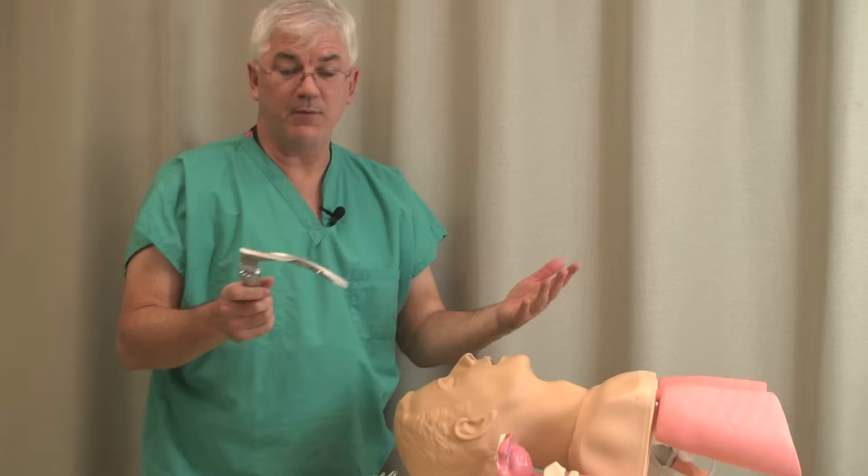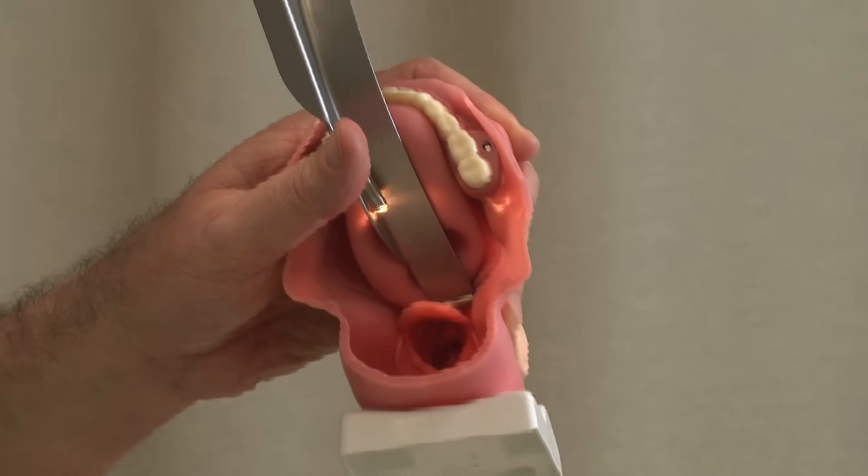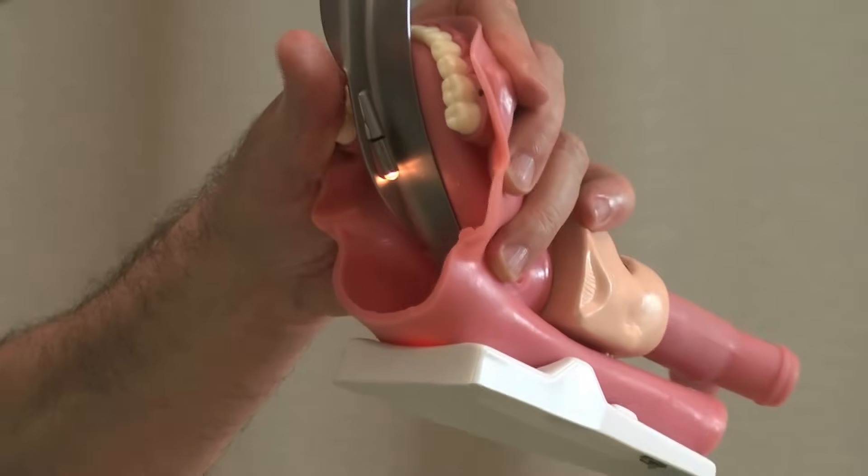Curved blade or straight blade? You can intubate with either. With the curved blade, we're going to go down and lift up in front of the epiglottis. Whereas if we had a straight blade, we would go and actually lift the epiglottis itself.